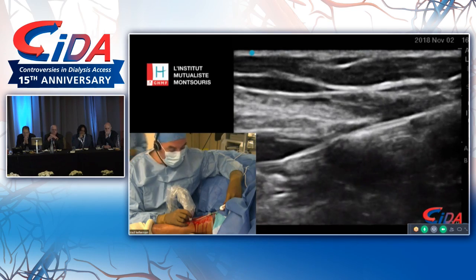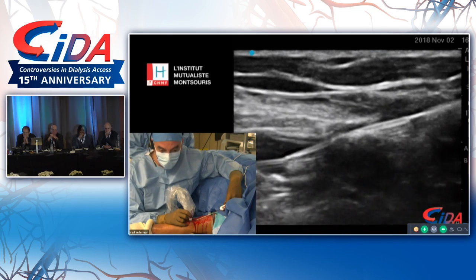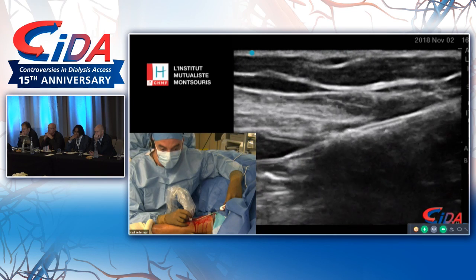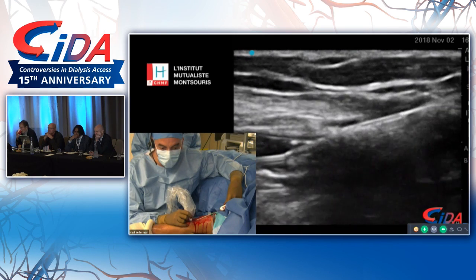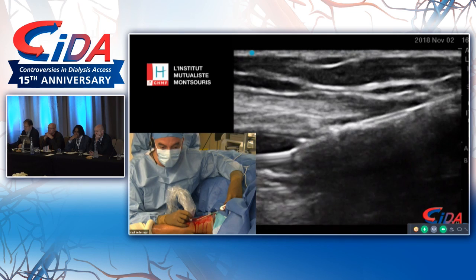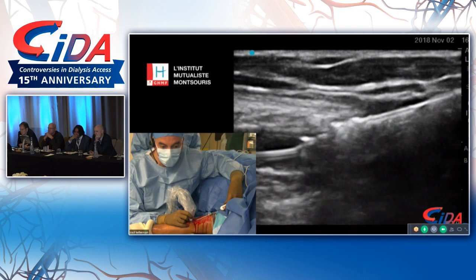And once this is done, I'm going to ask the nurse to activate the generator, which will give some short pulse of heating. You see the micro bubbles here from activation of the device. Okay, and now it's cooling. And I'm going to start applying some tension here. And once I feel it kind of gives way, I'm going to stop the procedure because the anastomosis, is it zero?